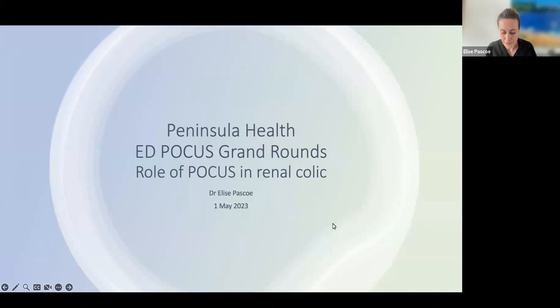All right, I will get started then. So this morning, we're going to start off by talking about renal ultrasound or renal POCUS in ED, in particular in relation to renal colic.